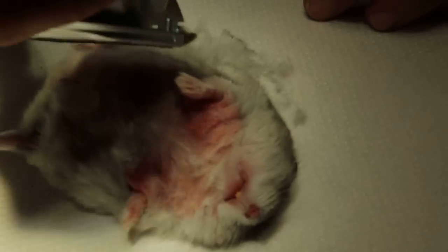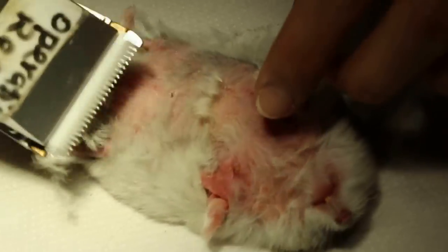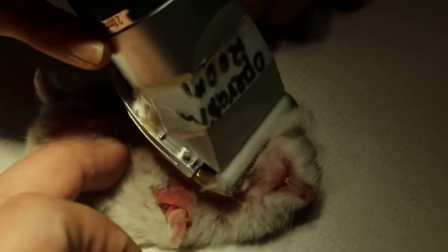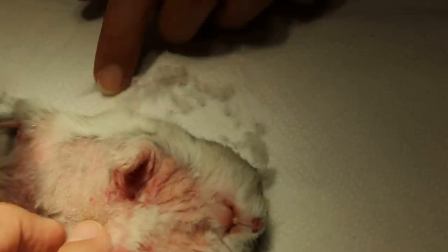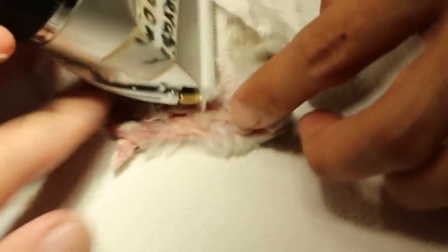We have to quickly shave off as soon as the hamster goes down, and take it out quickly, otherwise it will be overdosed and die from anesthesia. We shave as much as possible so that the owner can see the normal skin.